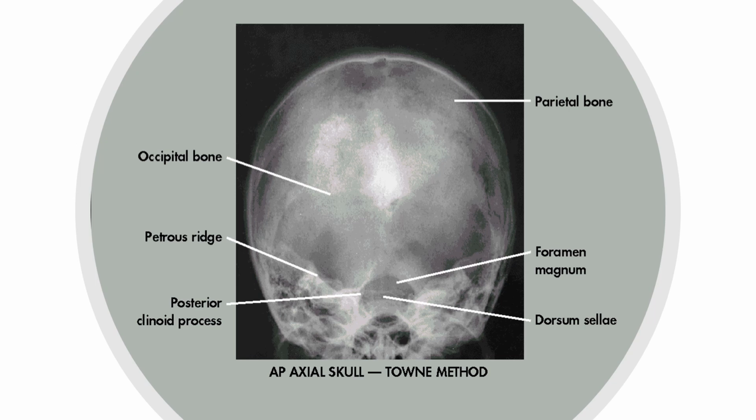So it corresponds to increased attenuation in the middle of what would otherwise be uniform attenuation. So the squamous portion of the occipital bone always has a bright spot in it, and that's always the internal and external occipital protuberances superimposing with each other. And it should be right in the middle of your radiograph if you do the Townes projection correctly with the correct centering.